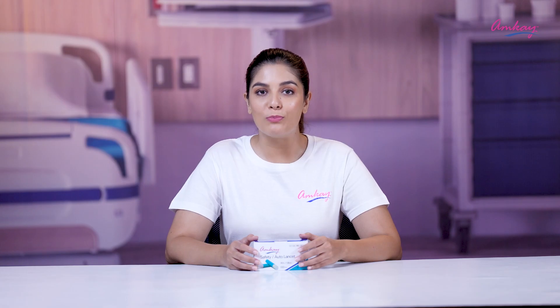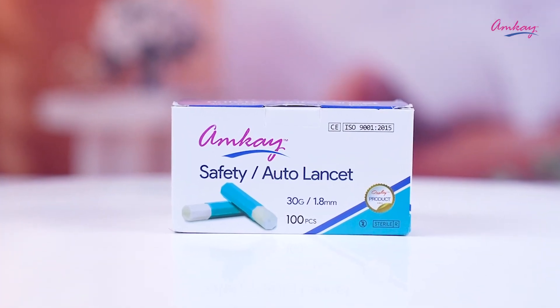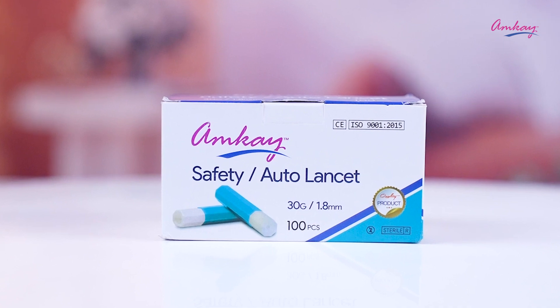Make your blood testing routine safe by using Amkay's auto lancet. This product is available on Amazon, Flipkart, other online portals, and medical stores near you.